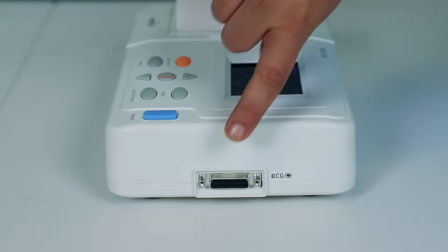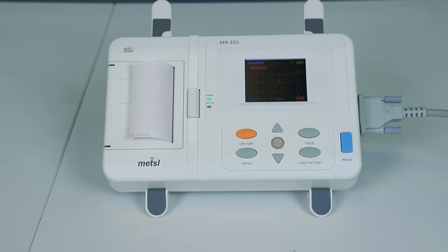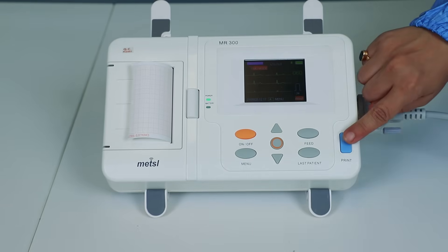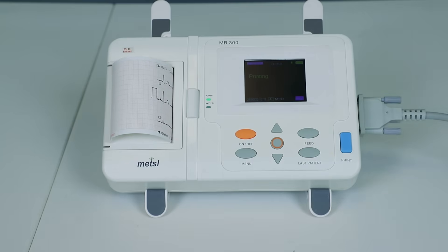Connecting the ECG cable to the device is straightforward — simply plug it into the dedicated port. With everything connected and the patient ready, taking a print is just a single press away. The machine quickly processes the data and provides immediate, high-quality ECG reports on the thermal paper.